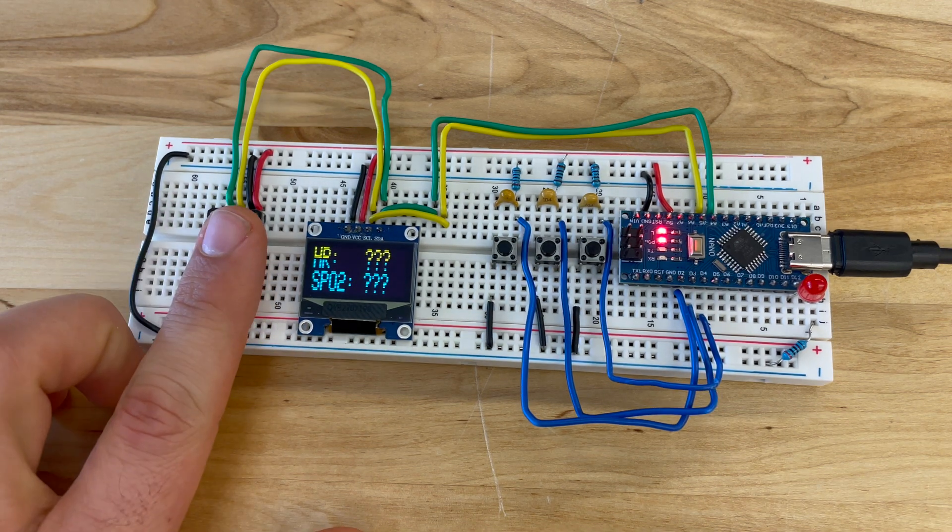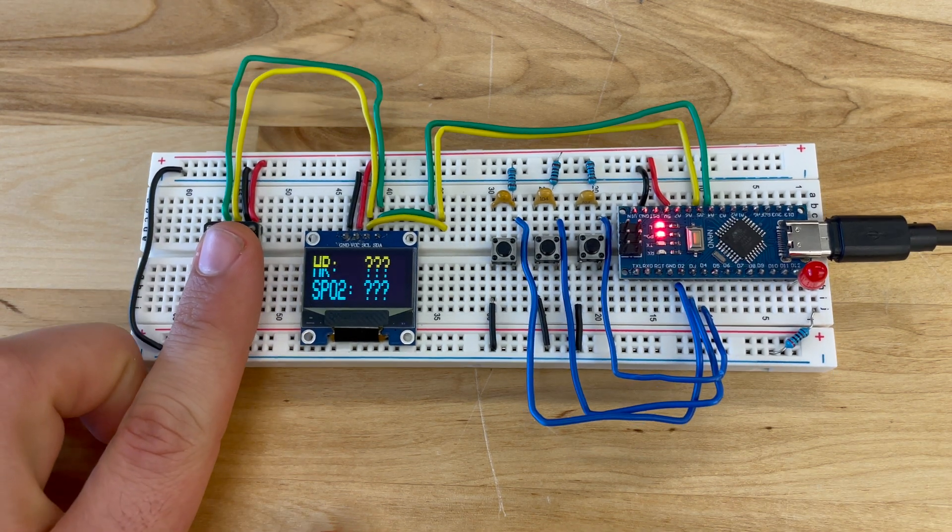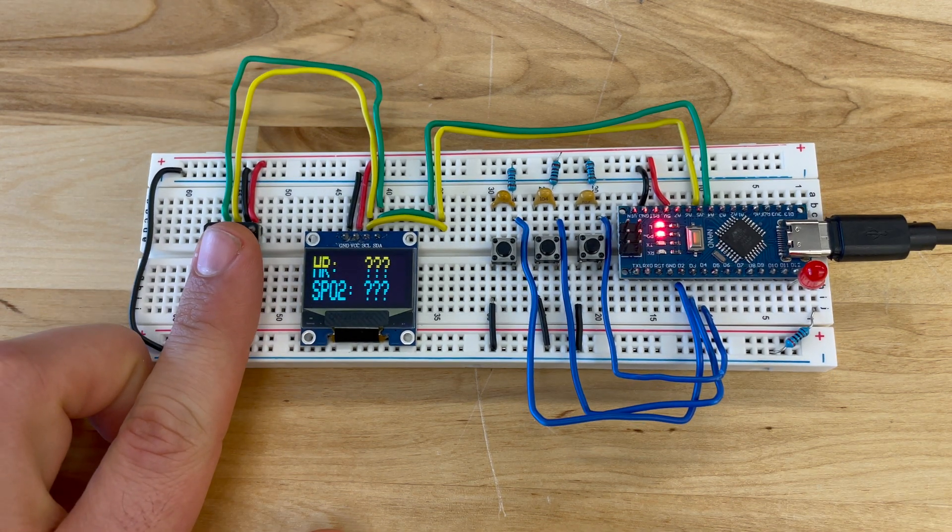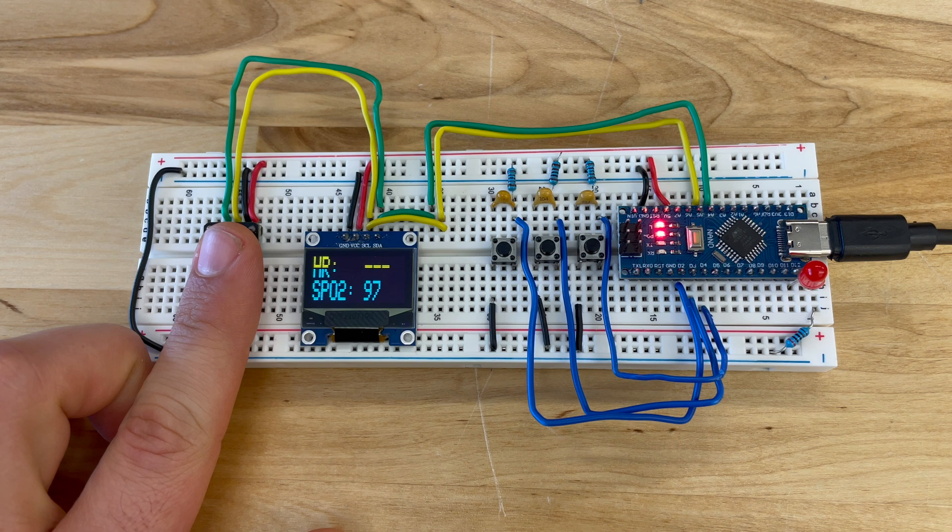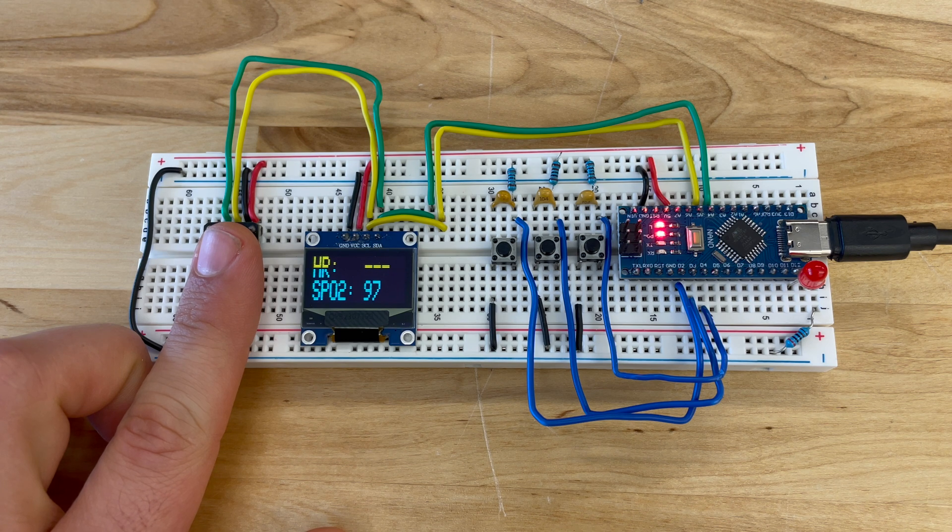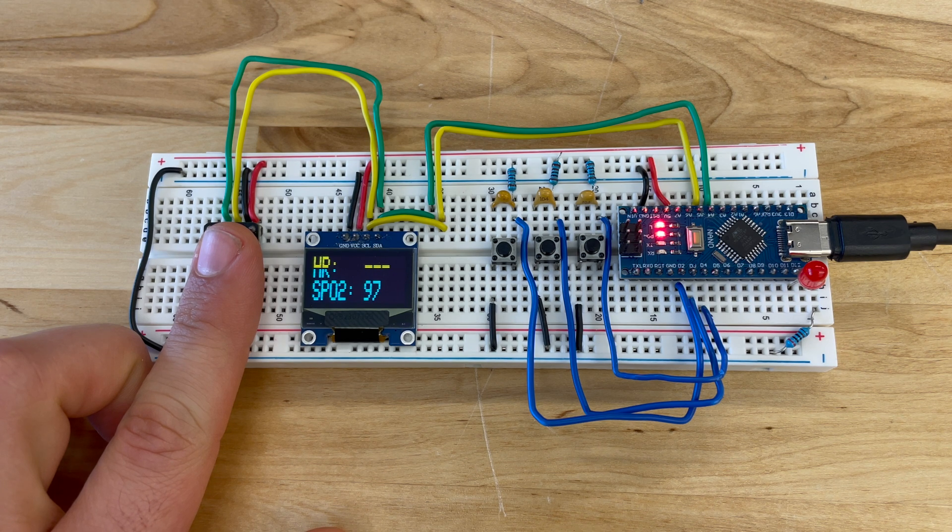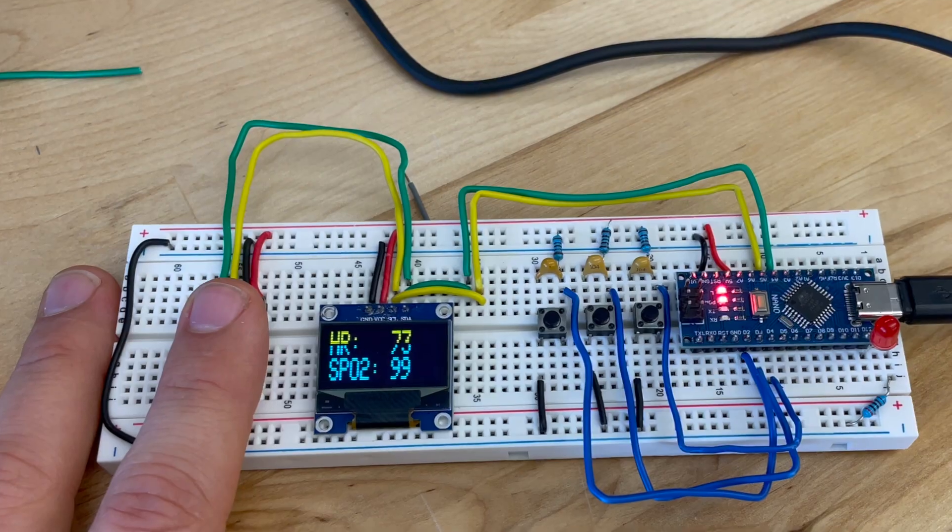This is the do-it-yourself pulse oximeter project, or do-it-yourself SPO2. This is able to measure your SPO2 and your heart rate.